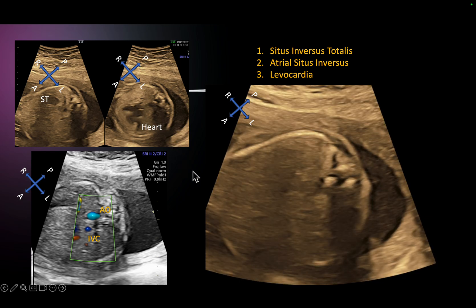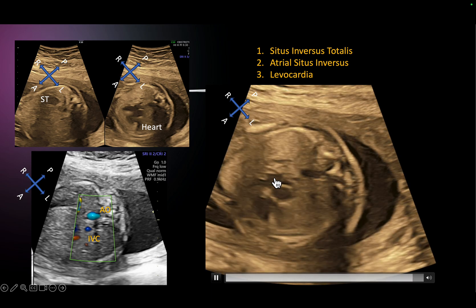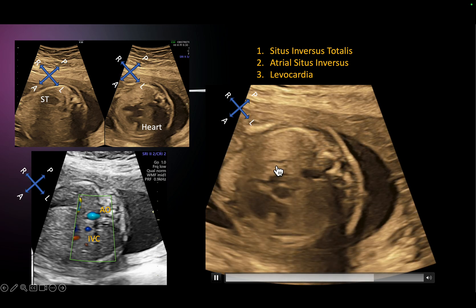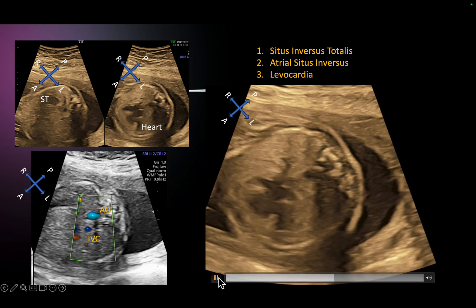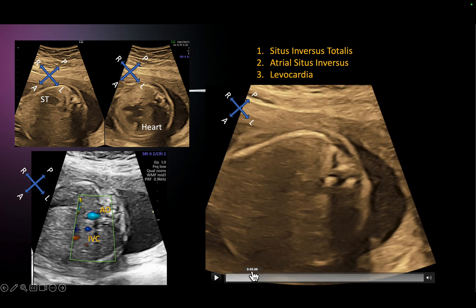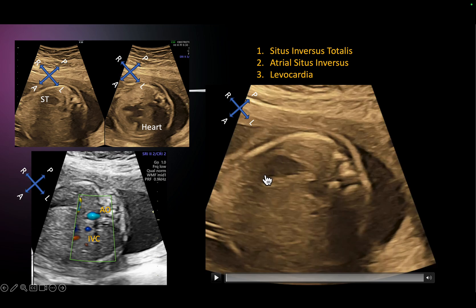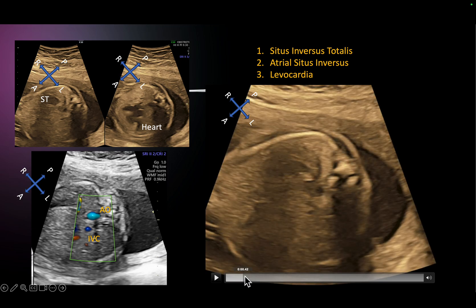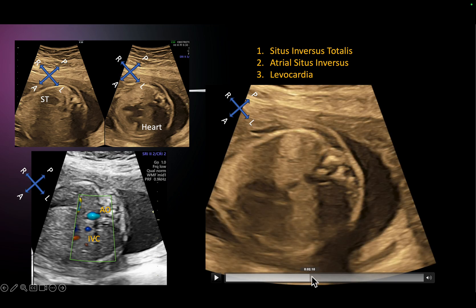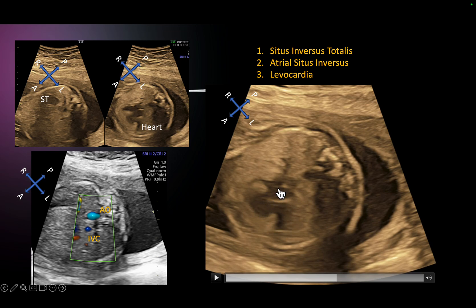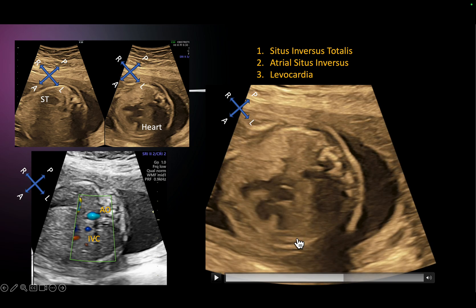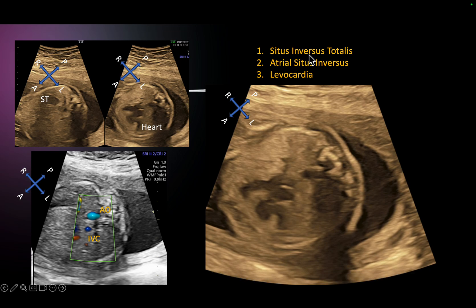Let's scan through the patient. This is the abdominal scan showing the stomach. I'll take you through step by step and explain each abnormality. This is the stomach; on this side is the aorta. As you go cranially, the stomach was on this side, the heart is on the left side, and you would see the pulmonary vein draining into this atrium, which is on the right side — the same side as the stomach.